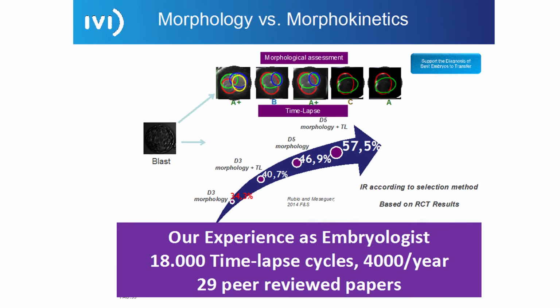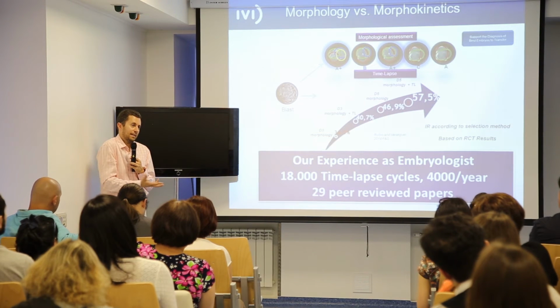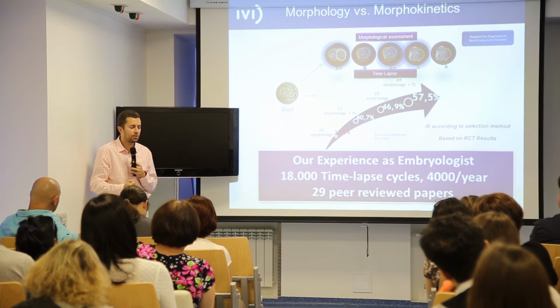And this is based on a randomized control trial, but I'm talking to you with our experience that is close to 20,000 cycles already done. So we have done a lot of cycles with time-lapse, and that data is coming with strong numbers.